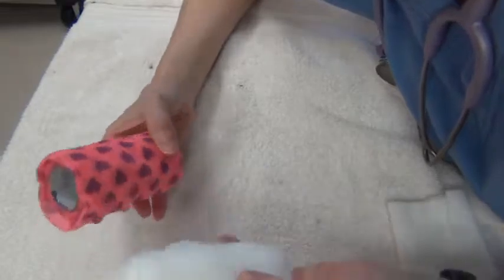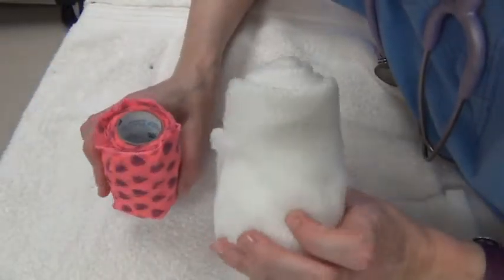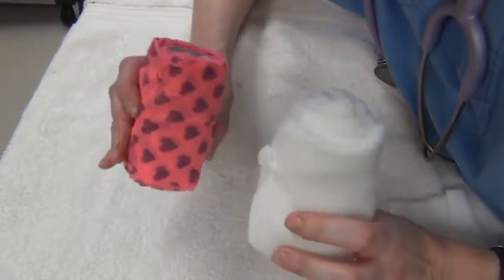Okay, before we do the carpal flexion, I'm going to go over the materials that I need. This one's simple. I'm just going to do cast padding and vet wrap.